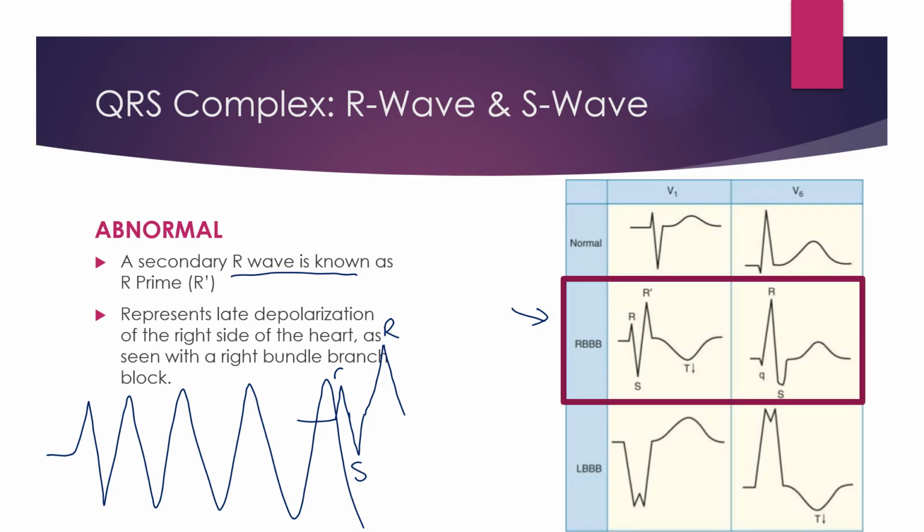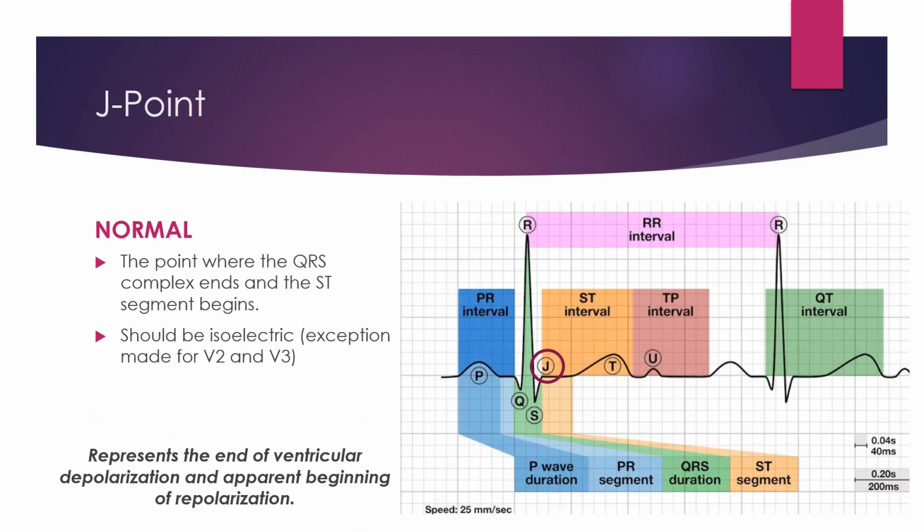That's not an RSR, that's VTAC. All right, next thing we're going to talk about is the J point. And to do that, we have to talk a little bit about the ST segment. Okay. So we have another slide for the ST segment, but we've got to talk about what the ST segment is. So this picture that we have shows the ST segment from here to here.